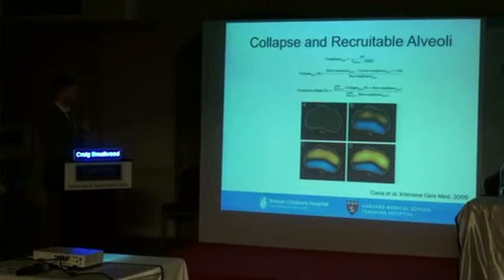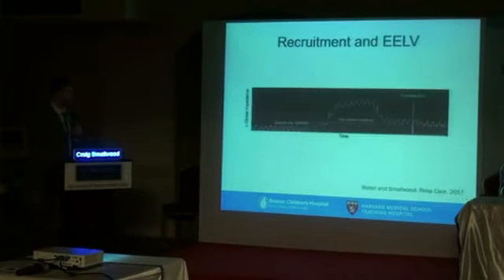But the task would be to use this information to resolve atelectasis, and then if this case series continued on, you would see them then titrate the PEEP down, so reduce the settings to maintain recruitment in those dorsal regions, and then simultaneously decrease the proportion of overdistension. So that's the general theory behind using this principle.